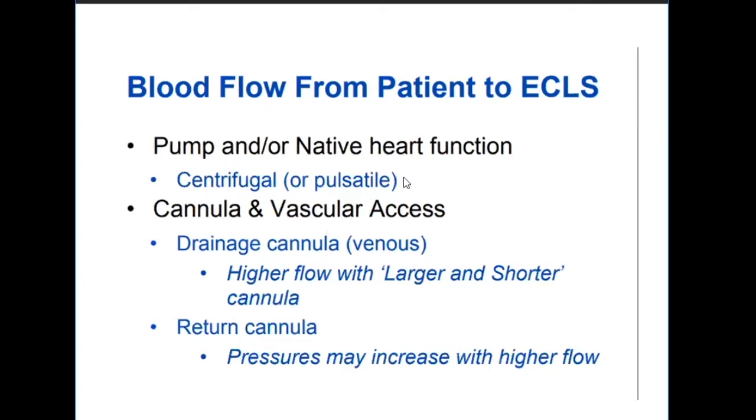Now, a pulsatile flow. Usually ECMO flow is not pulsatile. It is a simple flow. So the more pulsatile the flow, the more native heart function you have. So the pump, native heart function, and third is the cannula size, important.